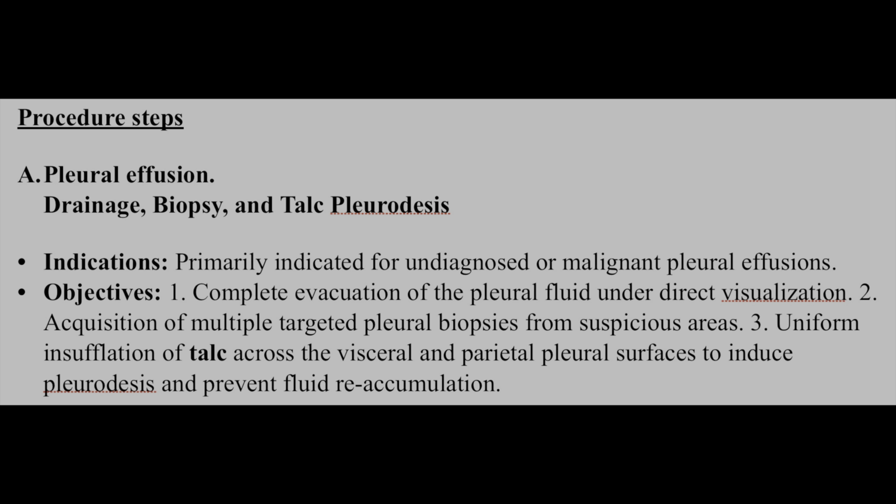Indications: it is primarily indicated for undiagnosed or malignant pleural effusion. Objective: complete evacuation of pleural fluid under direct visualization. Acquisition of multiple targeted pleural biopsies from suspicious areas. Uniform insufflation of talc across the visceral and parietal pleural spaces, to induce pleurodesis and prevent fluid reaccumulation.